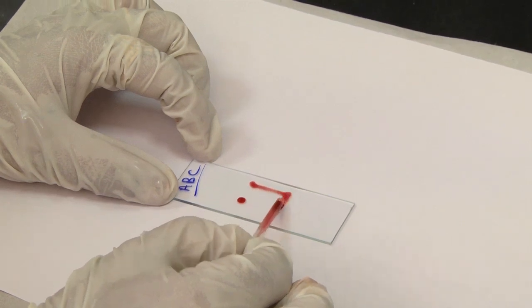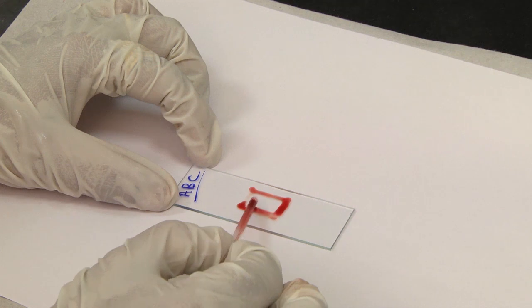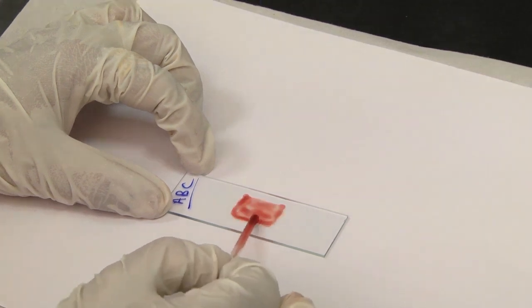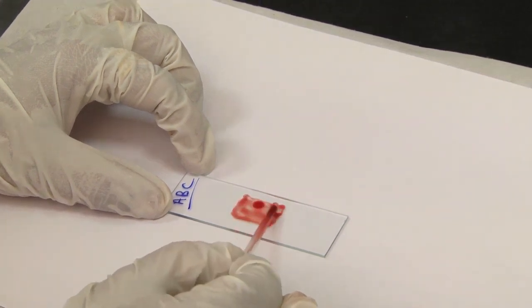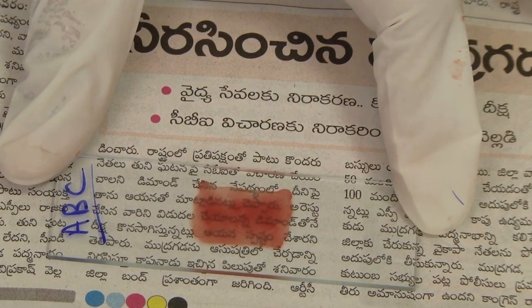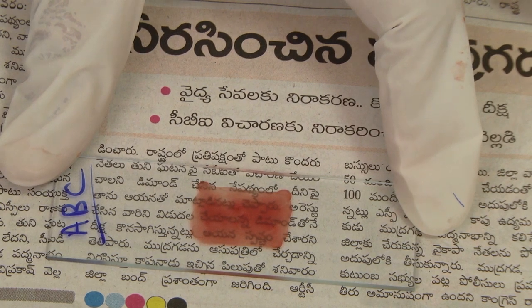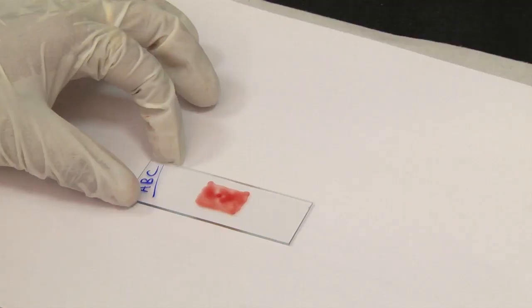Spread the drop of blood with the corner of another slide or an applicator stick to make an area about 1.5 to 2 centimeters in diameter. Correct thickness is attained when newsprint is barely legible through the smear. Lay the slides flat and allow the smears to dry thoroughly. Protect the slides from dust and insects.